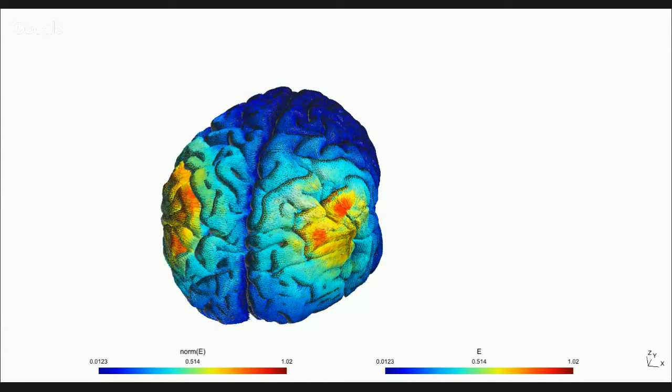Do you have models for an inflated brain? Yeah, you can just write it into, for example, FreeSurfer, use FreeSurfer to inflate and round it back. I have used this in a couple of papers. Sometimes it's really interesting to see where you are, that on top of the gyral crowns it's somewhere in the sulcal side, and then just blow it up. Is it biased towards the gyral crowns?